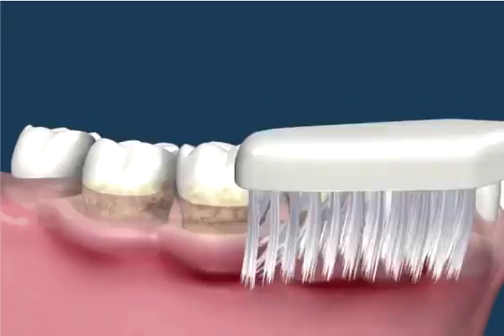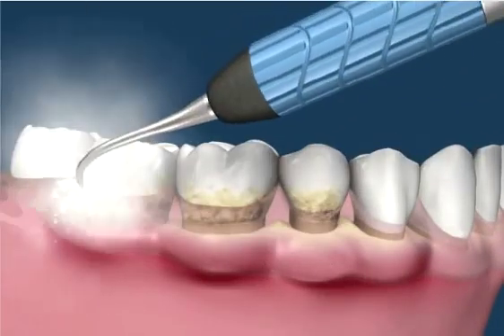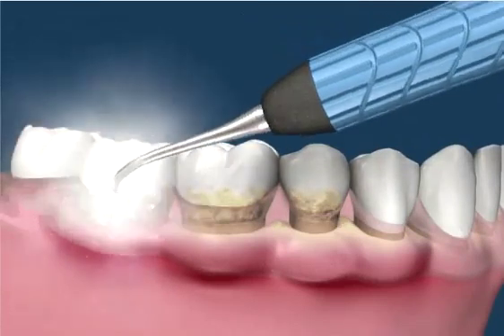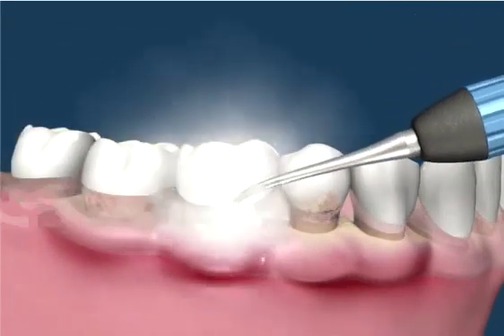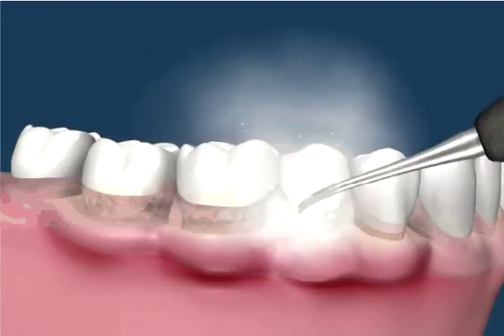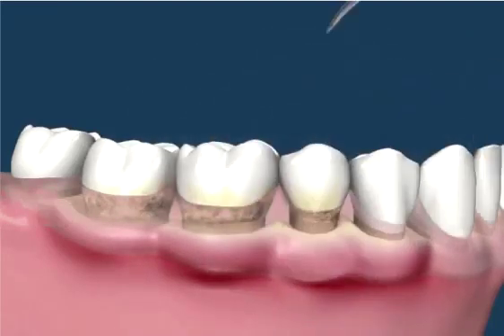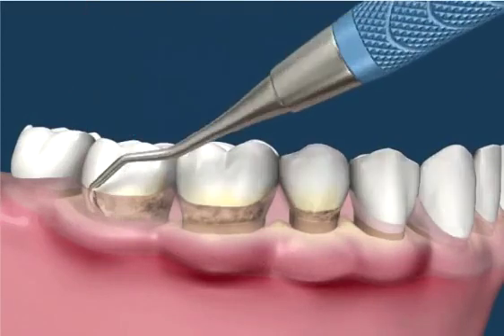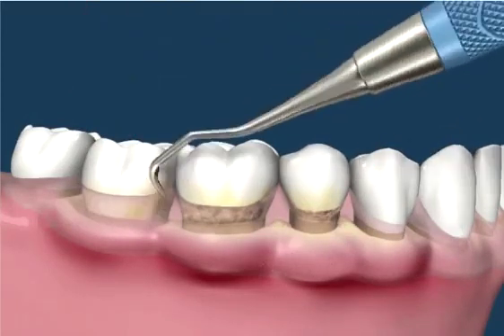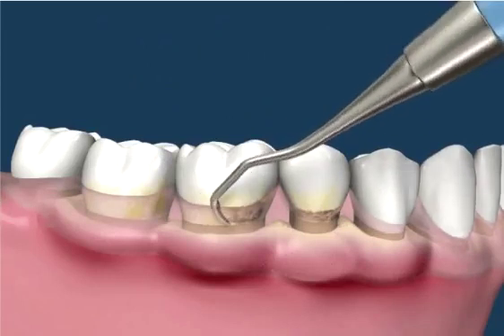The dentist or hygienist can use ultrasonic instruments that vibrate, together with a jet of water, to dislodge the calculus from the teeth. The fine amounts remaining, especially under the gums, may require hand scaling instruments to remove them. There are many specialized scaling instruments that can be used to remove the calculus from all areas.